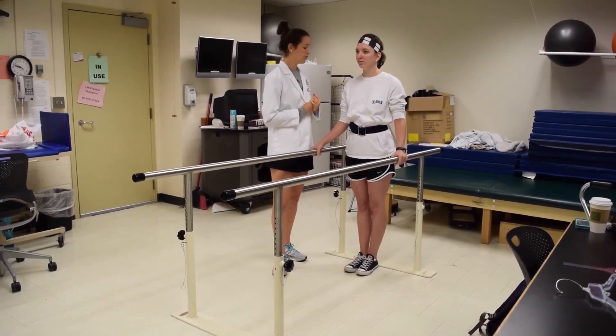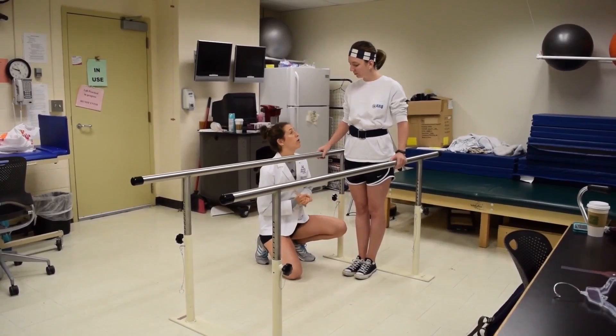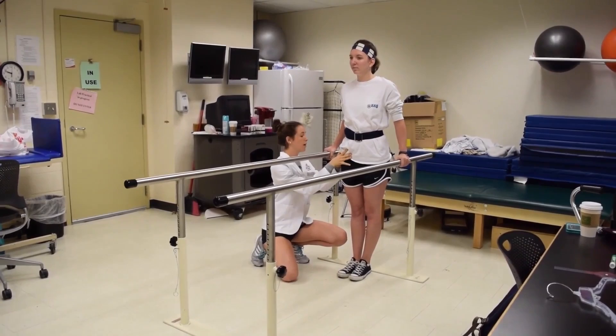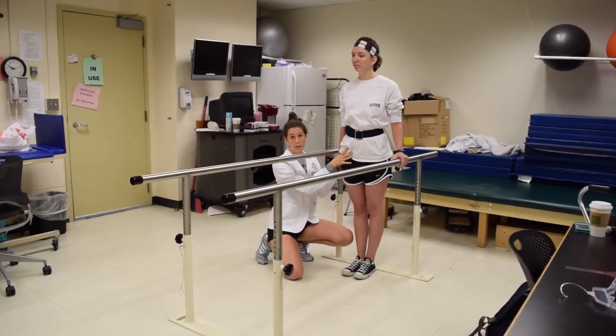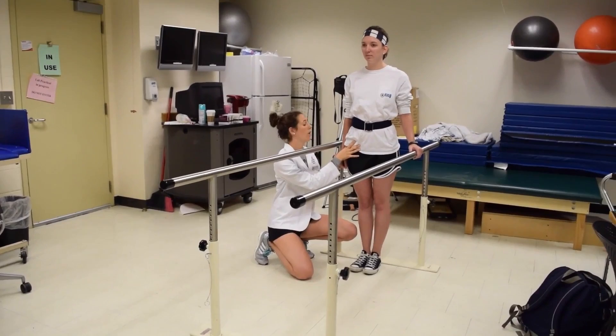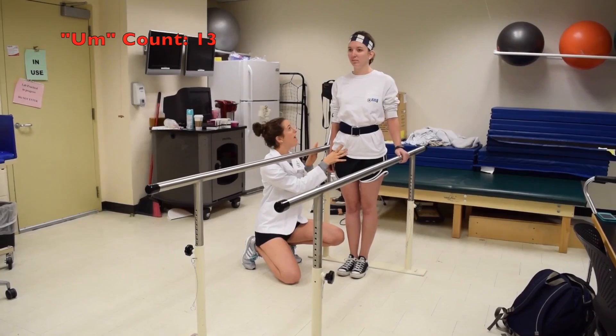The first thing we're going to do — Courtney, if it's okay with you — I'm just going to find your greater trochanter on the lateral part of your thigh on the outside here. I'm going to come down from her hip and I'm right on top of it here. So that's the first landmark we want to find. Another point you can look for on a patient is the crease of their wrist, or you can also look for the styloid process on the ulna. Her wrist crease is a little bit further down from her greater trochanter.